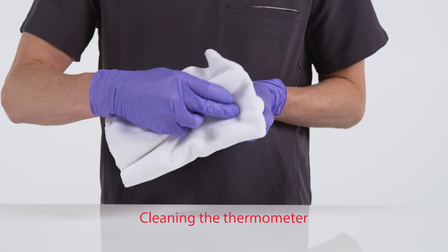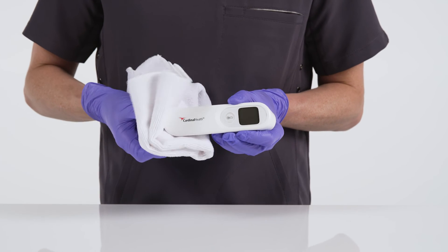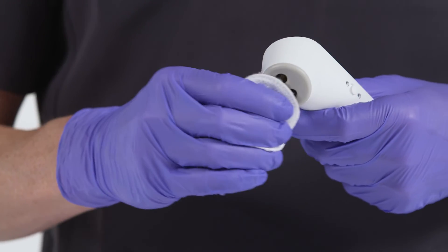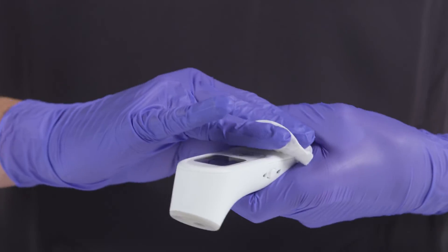For routine cleaning, gently wipe the device with a clean, soft cloth or cotton swab. Do not wipe the lens surface with an abrasive, as this may damage the sensor. To disinfect the product, gently wipe the surface of the device with a cotton swab lightly dipped in 70% isopropyl alcohol.